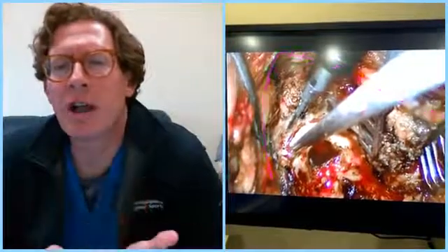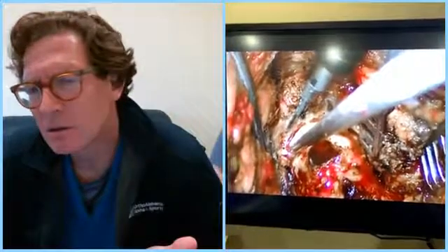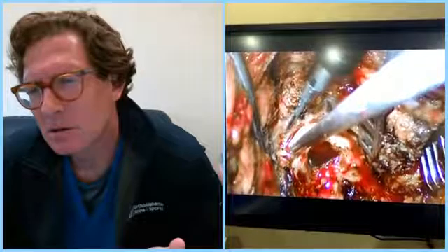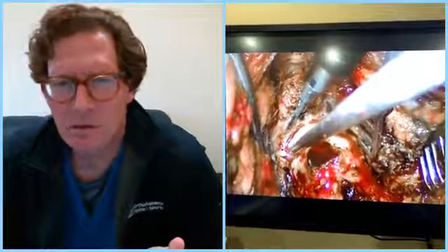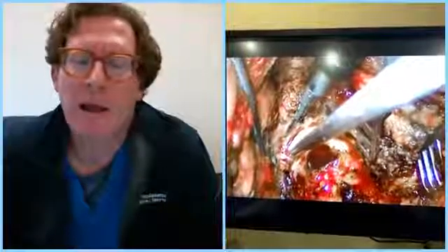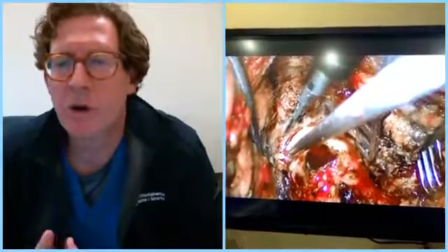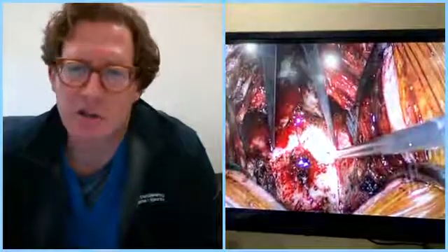So you're kind of shaving underneath the lamina? We're just dissolving inside the lamina what's pinching a nerve and saving the lamina. So rather than taking it off, we're hollowing it out. I got it. Because the tool is so precise and cautious around the spinal cord, it doesn't injure it.